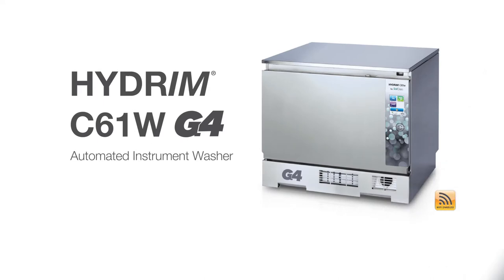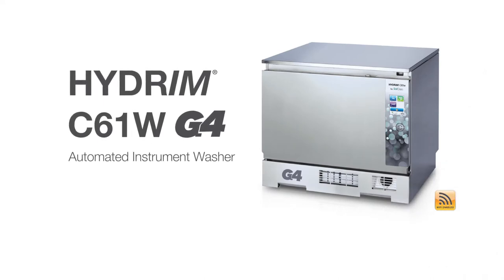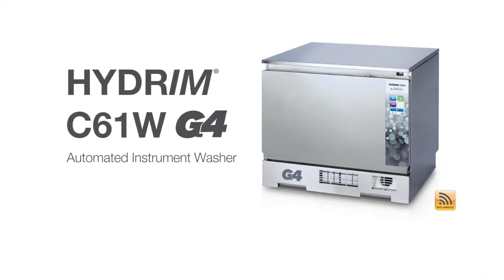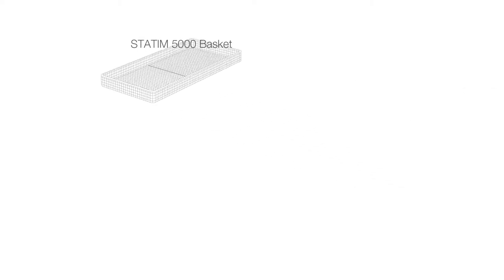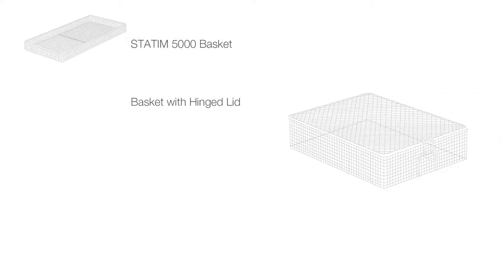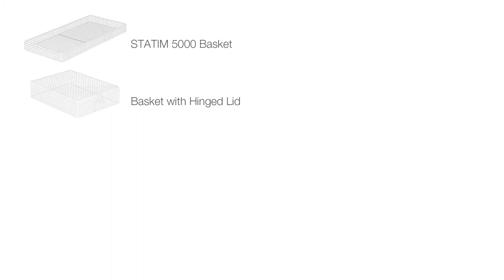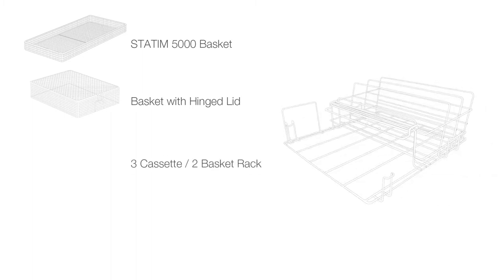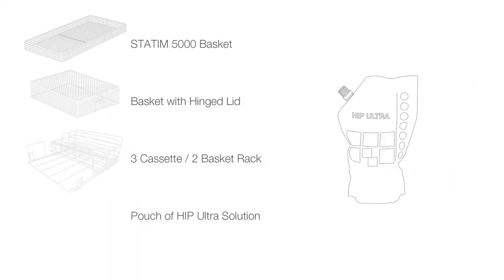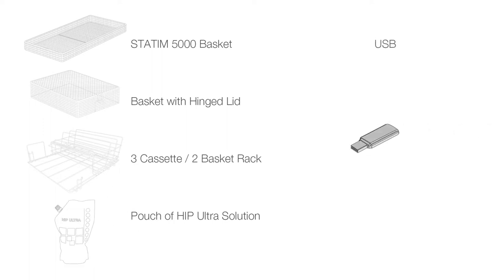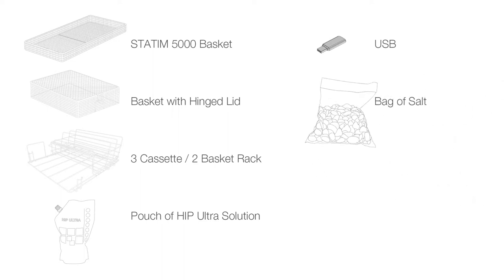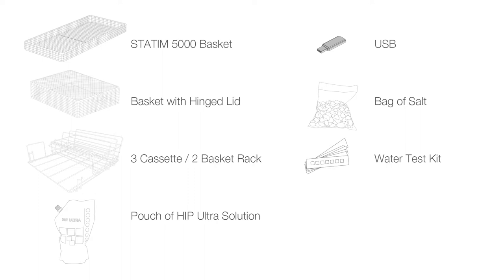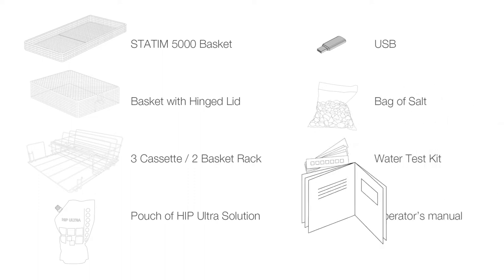Your Hydrum C61 instrument washer comes with the following items: Statum 5000 basket, basket with hinged lid, three cassette, two basket rack, pouch of HIP ultra solution, USB, bag of salt, water test kit, and operator's manual.